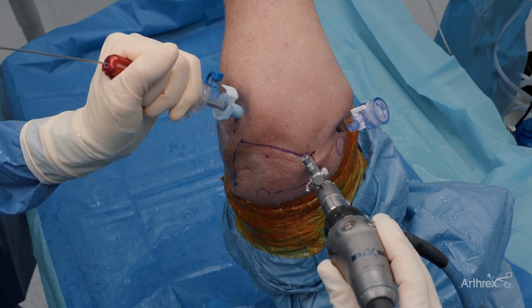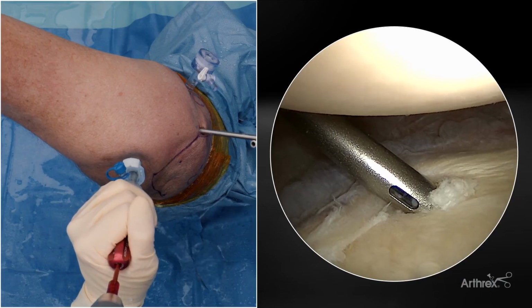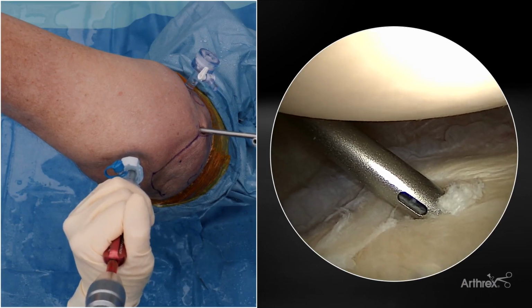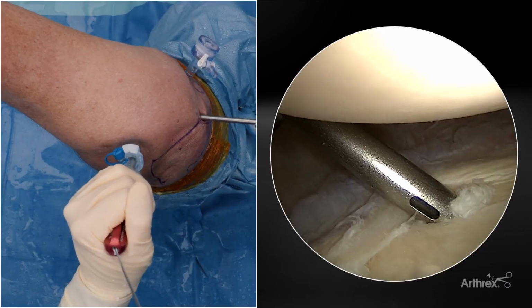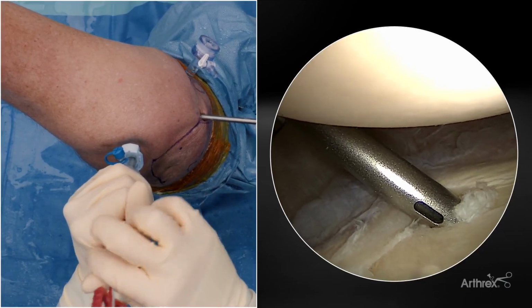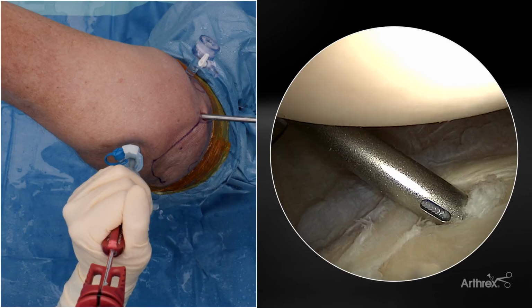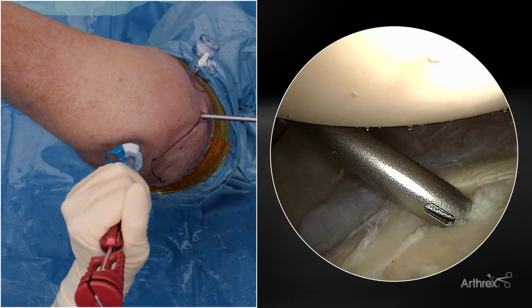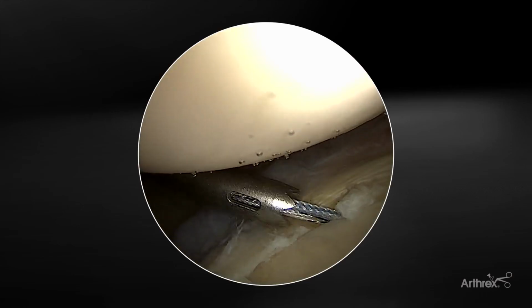And now we're going to drill full speed, allow it to self-center. It has a positive stop. We allow that as we pull it out. We don't worry about stopping the flow. We want that fluid to flush that out. We're going to put our anchor into place. So we get that down, and now I'm holding all the firmness with my left hand as I mallet that in place. We're going to set the anchor.